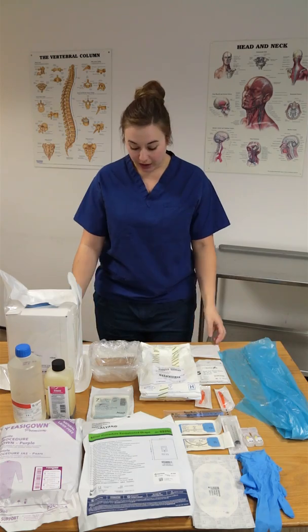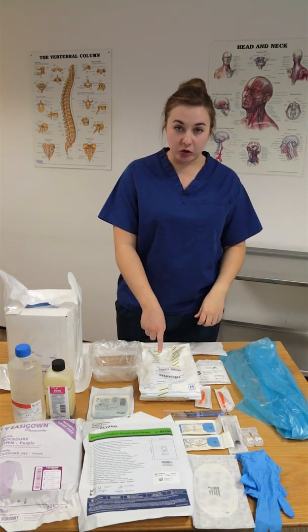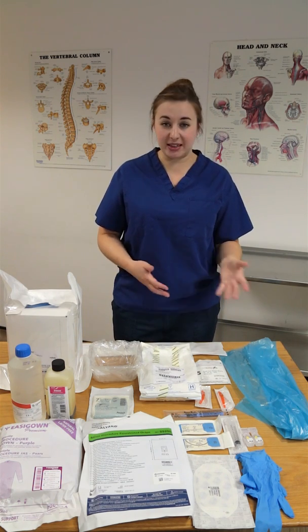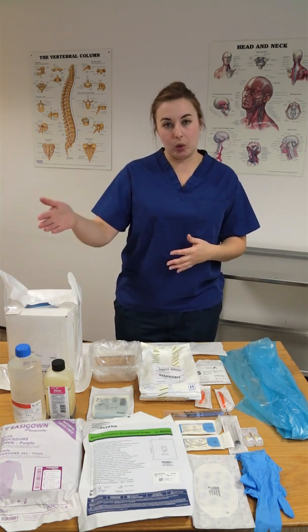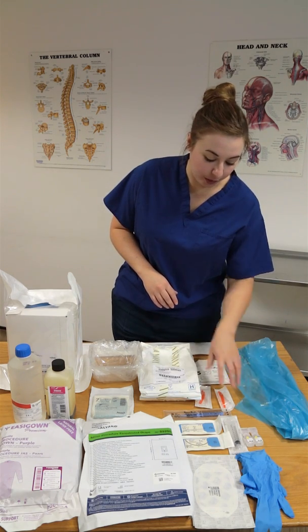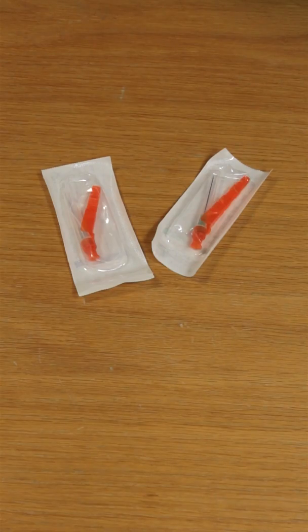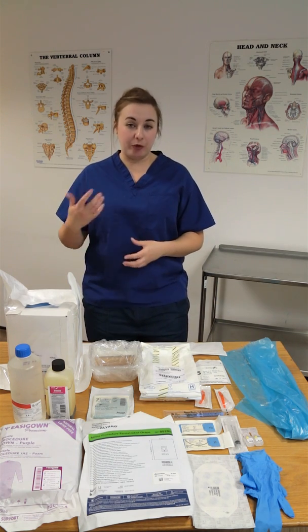For the drain itself, you'll use a size 32 or 28 French. You want your actual chest drain set, which will be provided by your CSSD in your trust and will come with all the implements you need to make the hole and insert the drain. Have a little bit of gauze for cleaning your patient. You're also going to need a 10ml syringe, some lignocaine, a drawing-up needle, and a giving needle — it's a painful procedure, so make sure your patient is properly analgesed before you start.